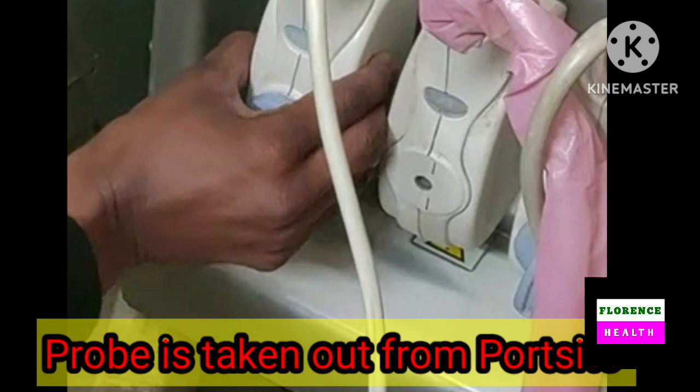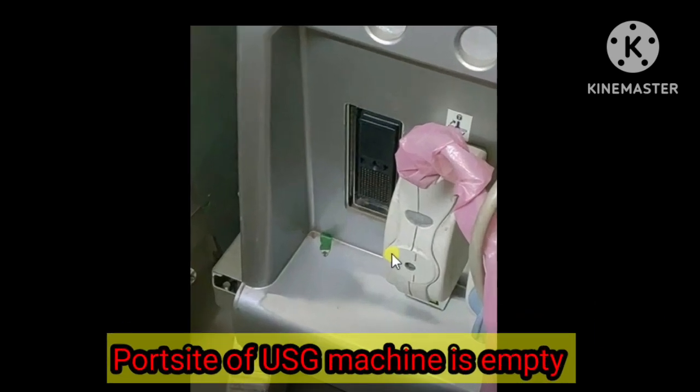Second step, after giving anti-clockwise rotation, probe is taken out from the port site of ultrasound machine. As probe is taken out, port site of ultrasound machine is now empty.